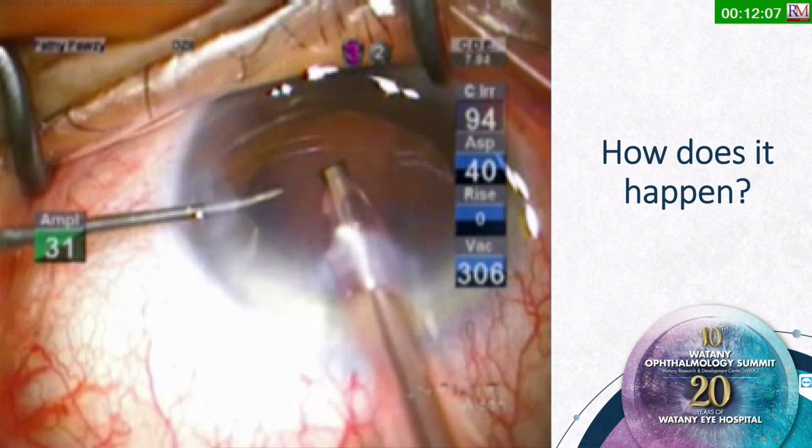Attend to his astigmatism, attend to the subincisional cortical matter for example, polishing of the anterior capsule, polishing of the posterior capsule, making sure the lens is in perfect position. All these things take extra few seconds each step.